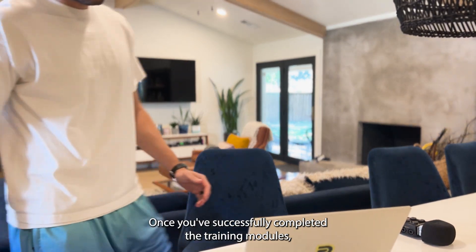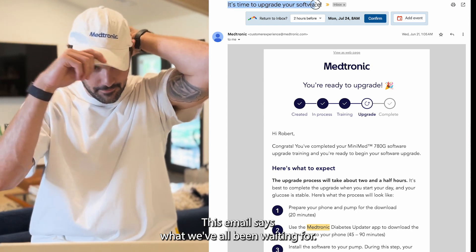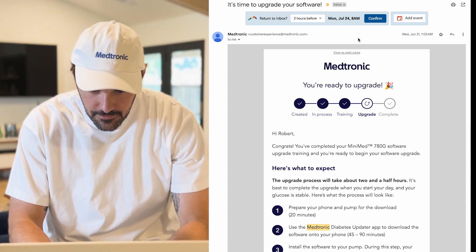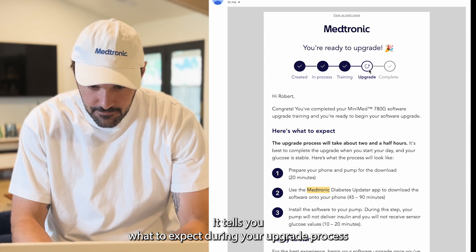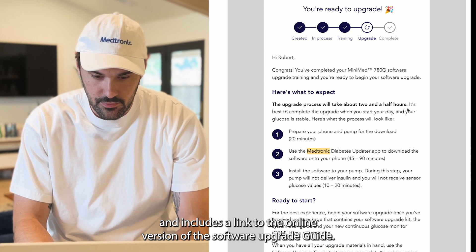Once you've successfully completed the training modules, you'll be able to receive your update email. This email says what we've all been waiting for — it's time to upgrade your software. It tells you what to expect during your upgrade process and includes a link to the online version of the software upgrade guide.